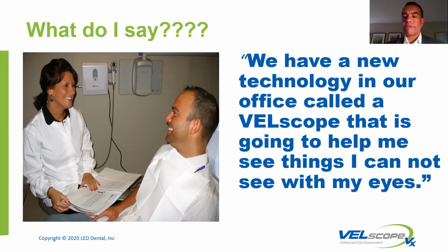We have a variety of verbiage that's available, so please contact us to get that. But it's a really simple statement that this is something safe and easy and fast. It allows us to see what you can't see with the naked eye. You can use comparisons like mammograms or pap smears without the radiation or discomfort. But at the end of the day, we're just helping to see, just like we take x-rays of your teeth to see potential disease, we're using this technology to help see below the surface that we can't see with the naked eye. So we know that reimbursement is a critical factor in determining acceptance, but we also know that when patients understand the value of the technology, they're more apt to accept the technology.